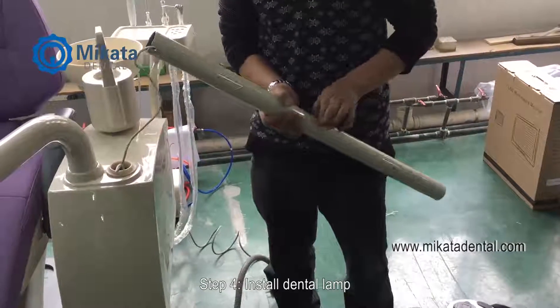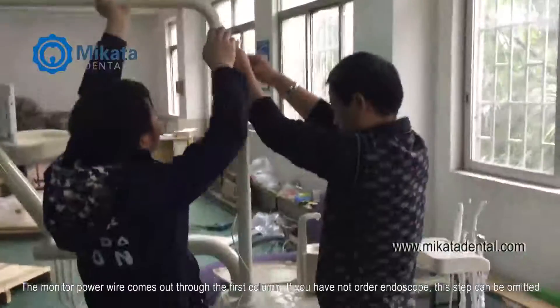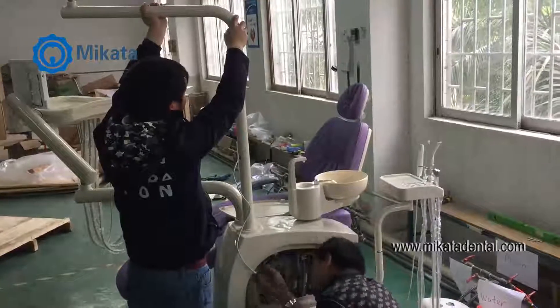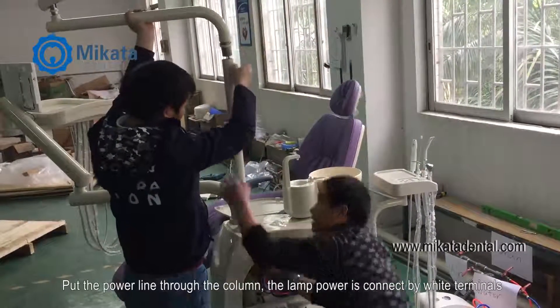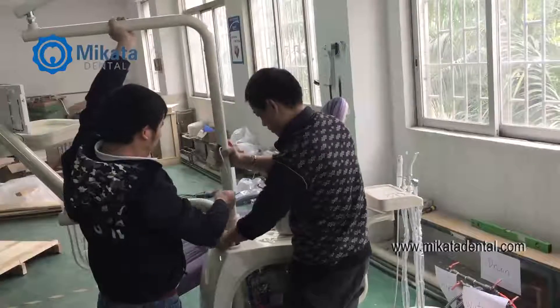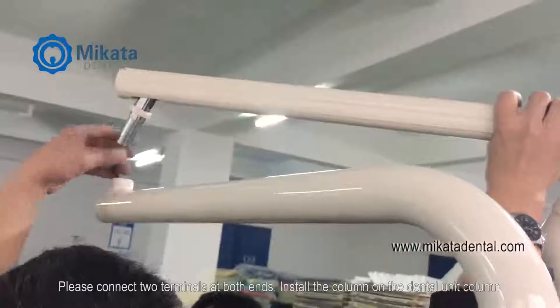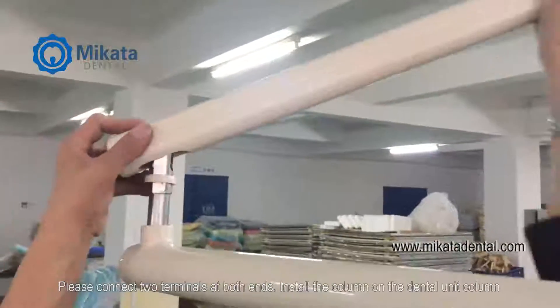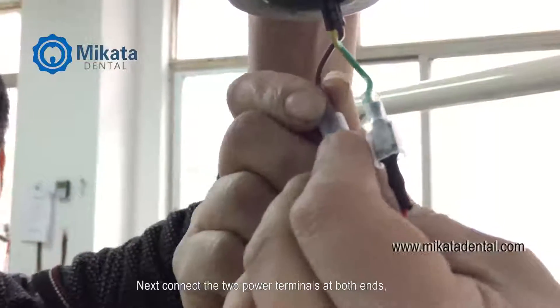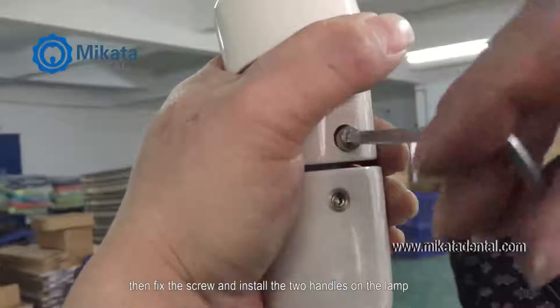Step 4. Install the dental lamp. The monitor power cable comes out through the first column. If you have not ordered an endoscope, this step can be omitted. Put the power cable through the column. The lamp power is connected by white terminals. Please connect the two terminals at both ends. Install the column on the dental unit column. Next, connect the two power terminals at both ends. Then fix the screw and install the two handles on the lamp.